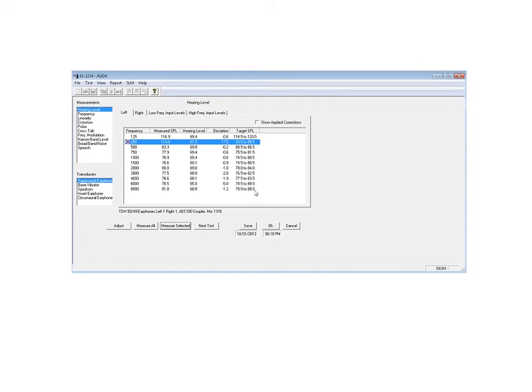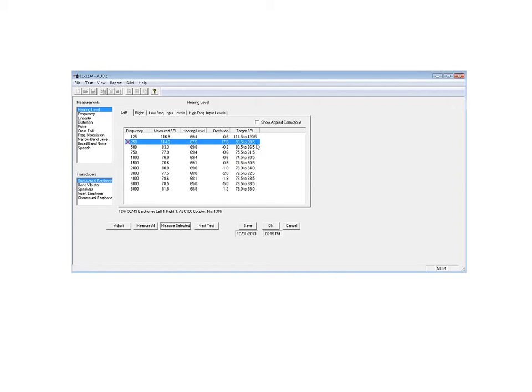And it brings in the level of the calibrator at 114.0 measured sound pressure level. It turns out at 250 hertz that exceeds the target sound pressure level of 99.5, so audit software puts in a red X indicating that at this point the test has failed, and you may need to retest or substitute a different earphone. Something in the system isn't working right.